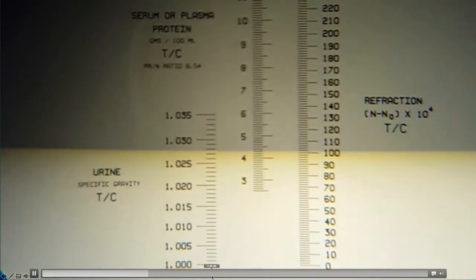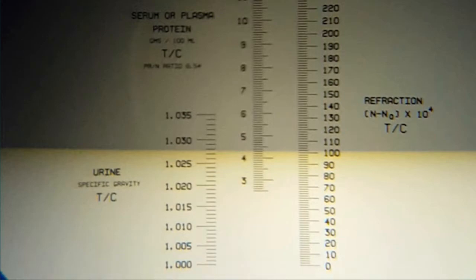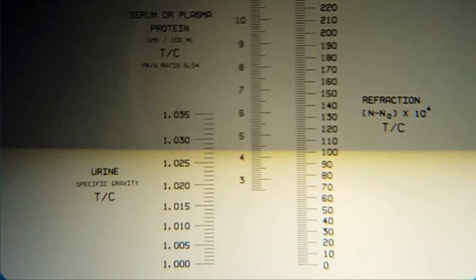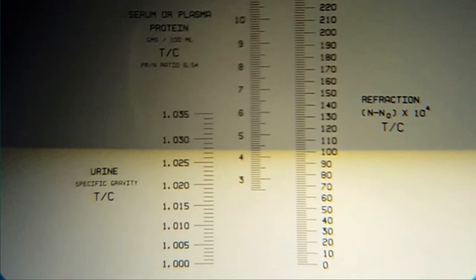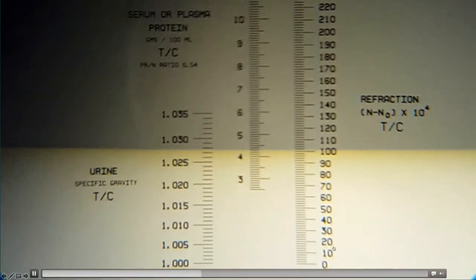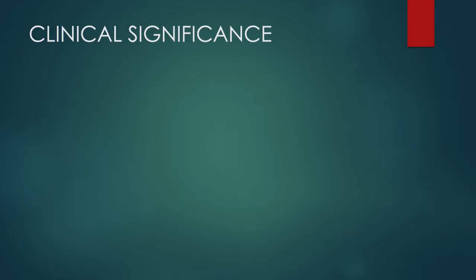Walk under the light, look into the refractometer like a telescope, and look for the different scales. On this particular refractometer, the specific gravity scale is on the lower left-hand side. Look at the lower left scale, find where the black line crosses the scale, and read off that value — that is the specific gravity of the urine. This covers how to measure specific gravity of urine using both the urinometer and the refractometer.